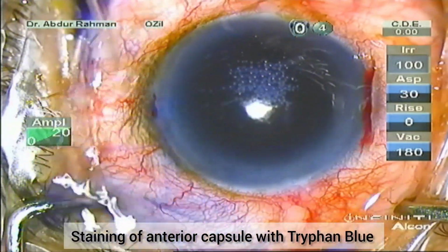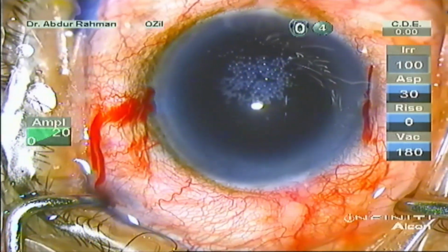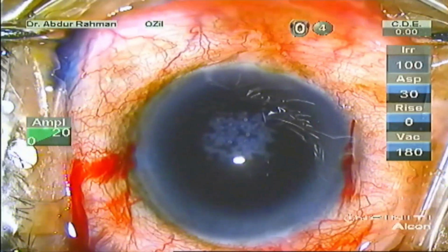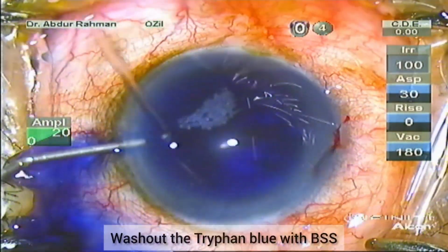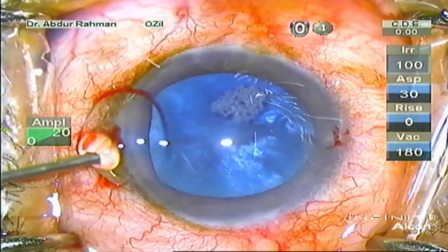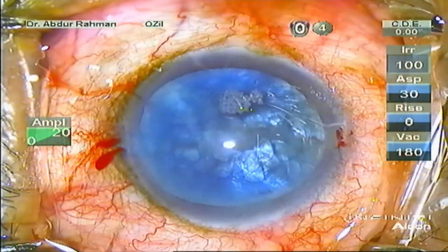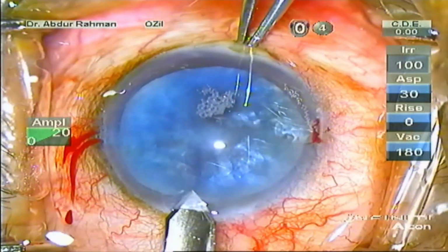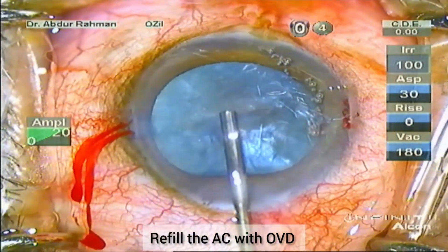Now I'm going to stain the anterior capsule with Trypan blue. Now gently wash out the Trypan blue with BSS and form the AC with OVD. Now with the help of a 2.4 mm keratome, make a main port.